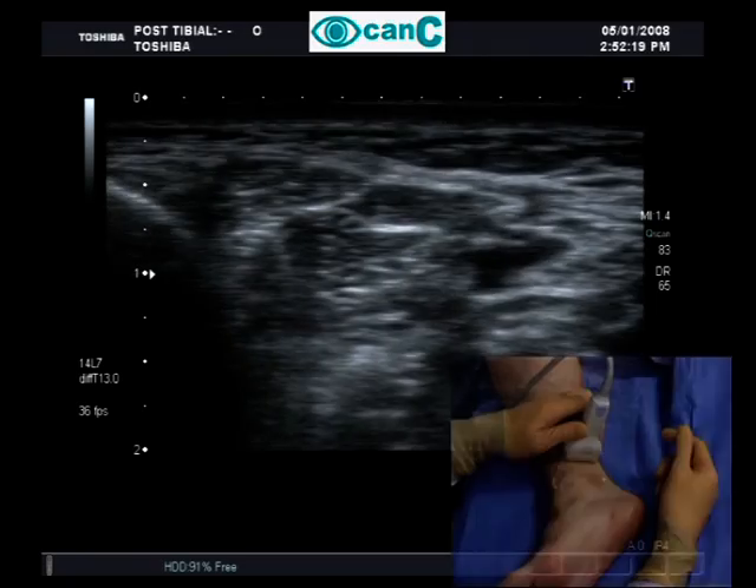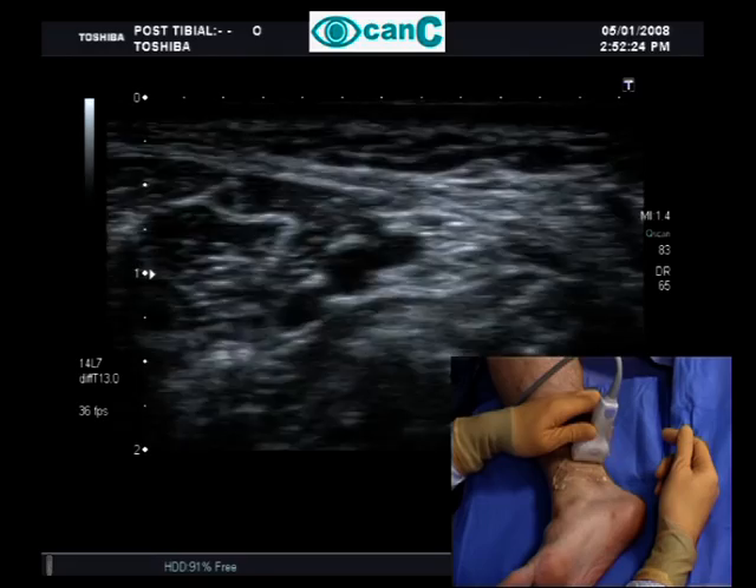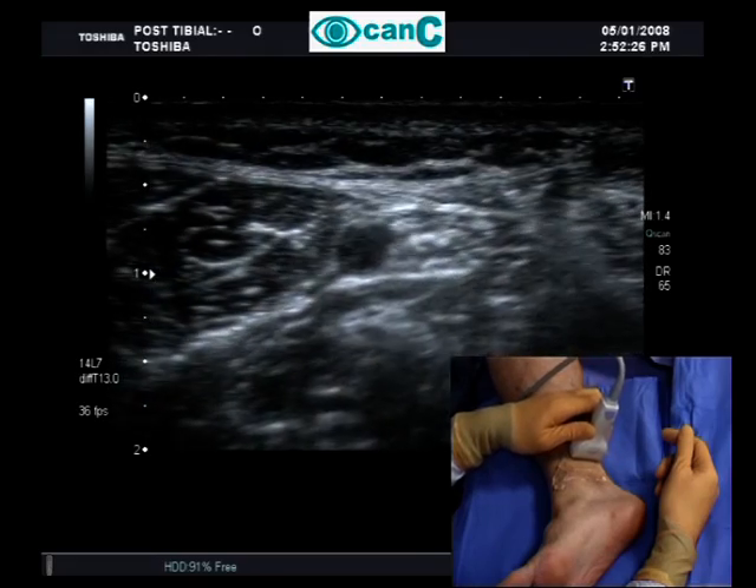Moving the probe anteriorly identifies the medial malleolus of the tibia. Ballotting the vessels helps to identify the nerve.